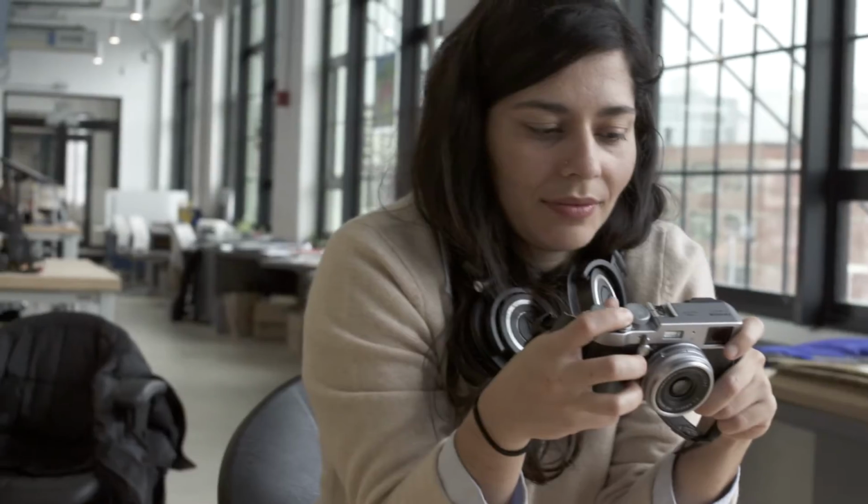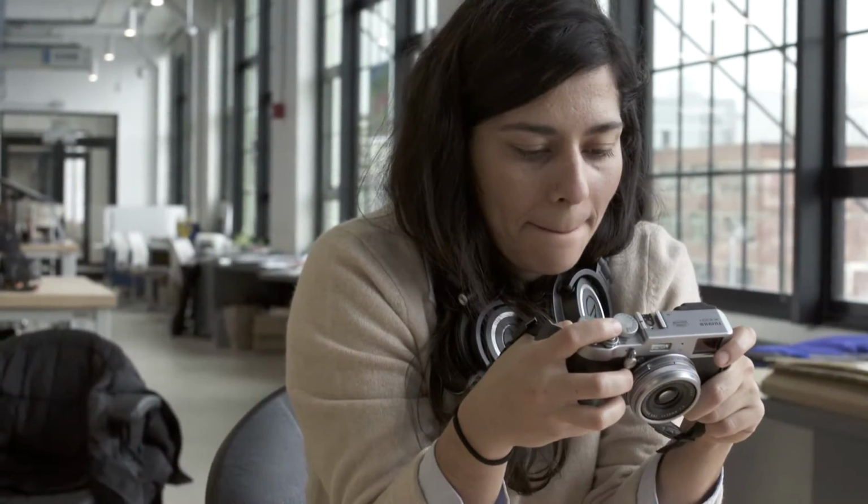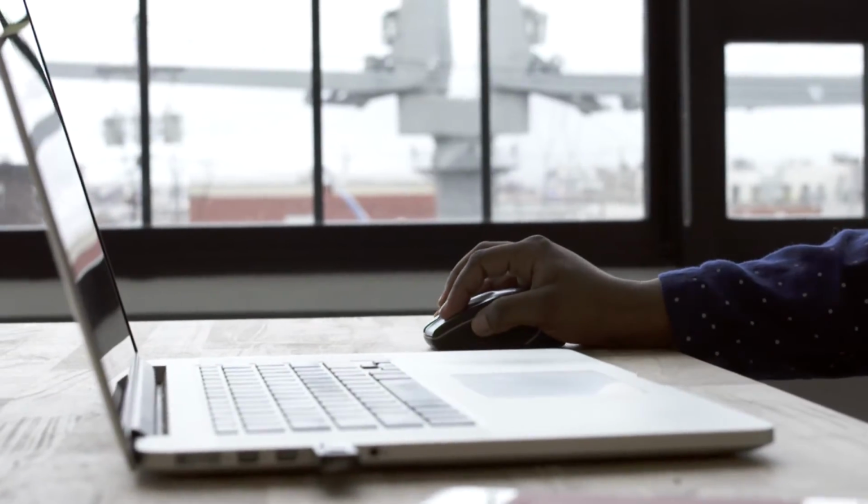Okay, in developing a prosthetic socket, the patient or the amputee goes to visit the clinic where the prosthetist works, and they meet with the prosthetist, and then the prosthetist takes measurements of the residual limb, and after taking measurements, the prosthetist takes a plaster cast of the residual limb just to get the shape of the residual limb.